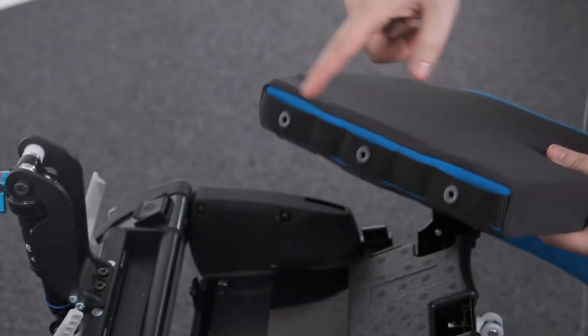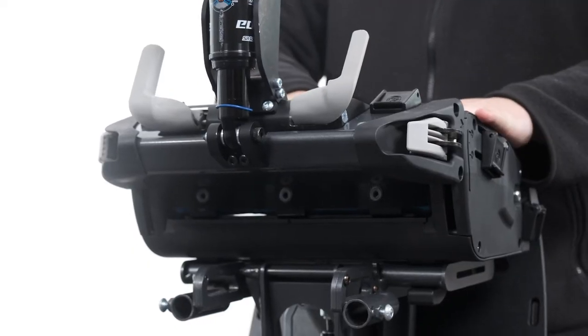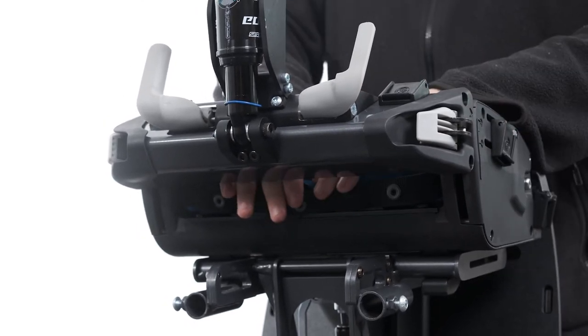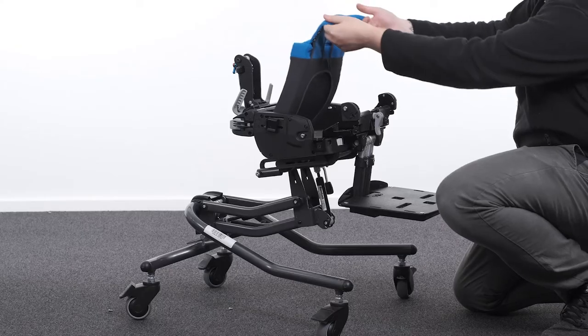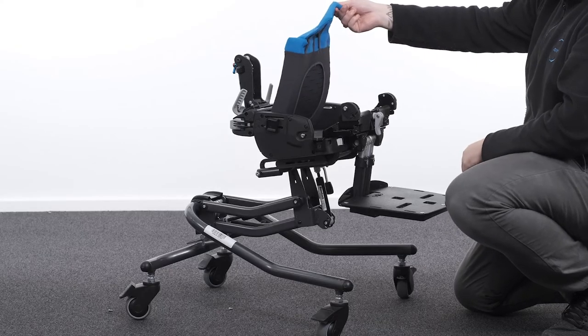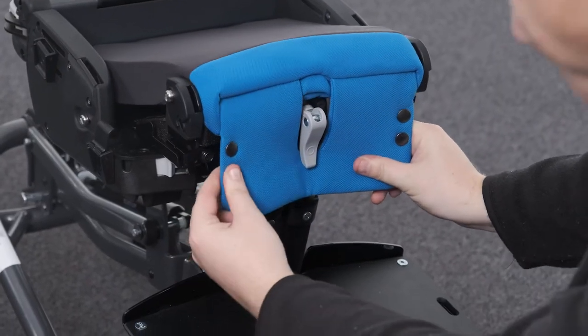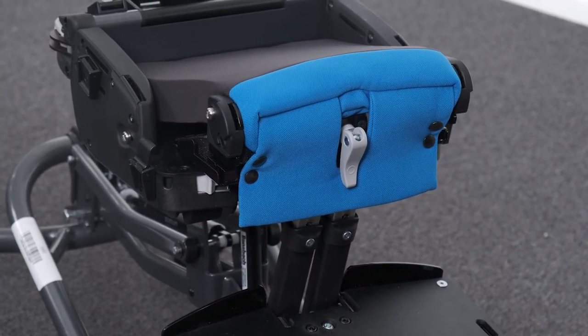Attaching the basic seat cushion. To attach the basic seat cushion to the back of the seat, locate the row of snap fastener tabs at the back of the seat base. Slot the fastener tabs between the seat cushion and the webbing and secure in place with the fasteners. To attach the front of the basic seat cushion, locate the snap fasteners at the front of the seat base. Drop the front flap of the seat cushion down and secure in place with the fasteners.